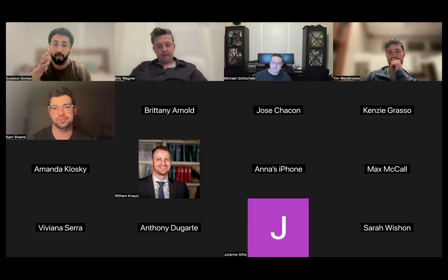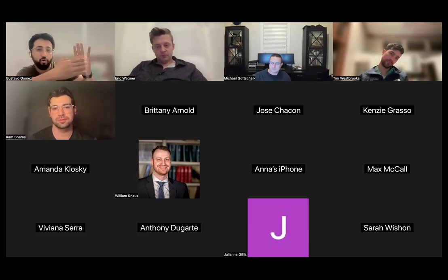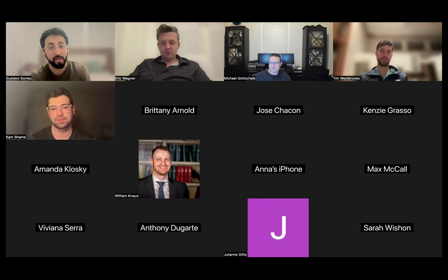Most of the time, you can see the dorsal ulnar fragment just placing the scope at the 3-4 portal, and then if you turn the scope and you look ulnarly, and you turn the 30 degrees of the scope, you can see exactly the dorsal aspect of the lunate fossa. So sometimes it's not necessary to do the volar portals. For me, it's not the most common thing.